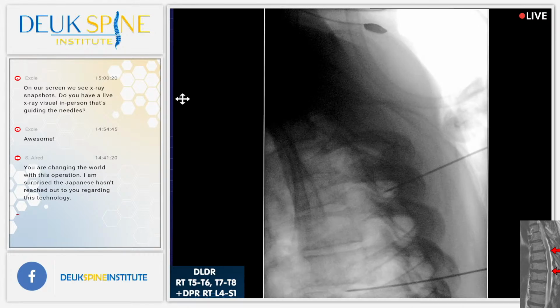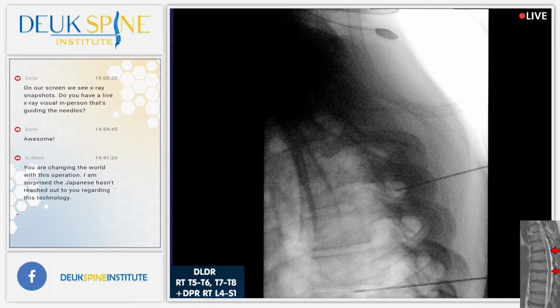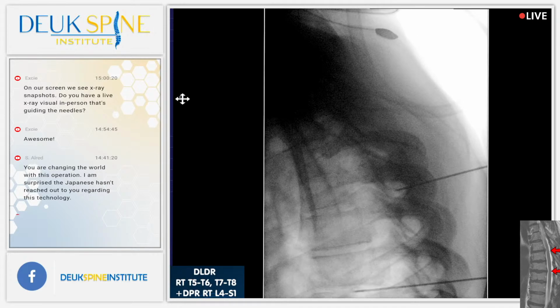Yeah, you do. There's no doubt. That's what I'm dealing with. What I'm trying to figure out is, if you don't have much pain up here, is it worth the risk? Maybe we don't take the significant risk that it takes to get down to that disc, because I'm encountering a lot of bone. I cannot find a way around it at the top one, which is the one that doesn't bother you that much. Let's get an AP. What do you say? I'm just thinking out loud for you.